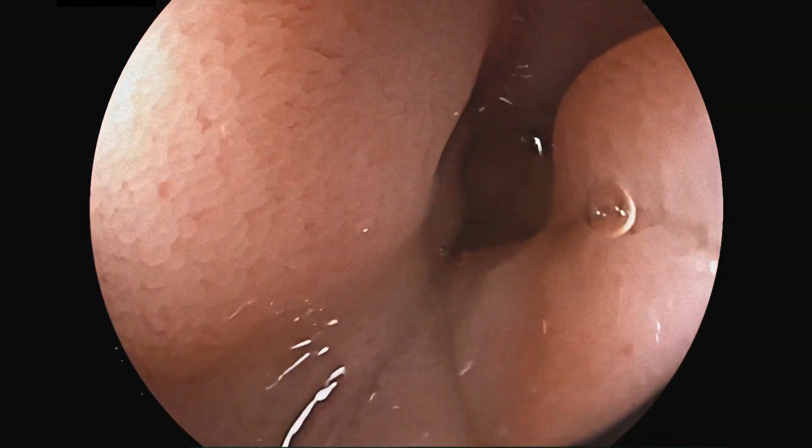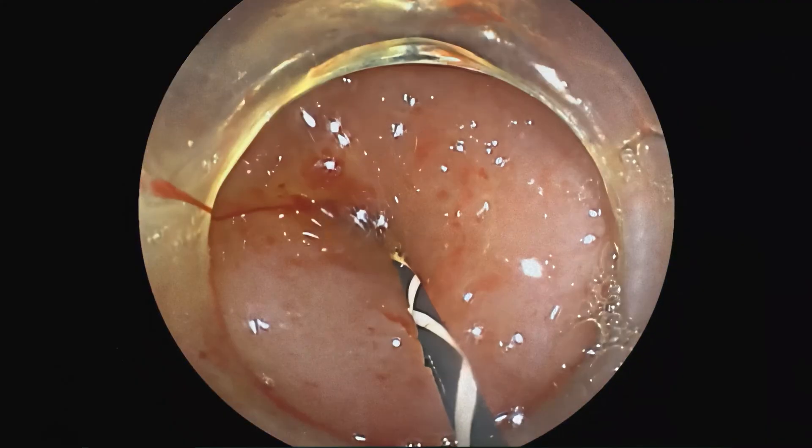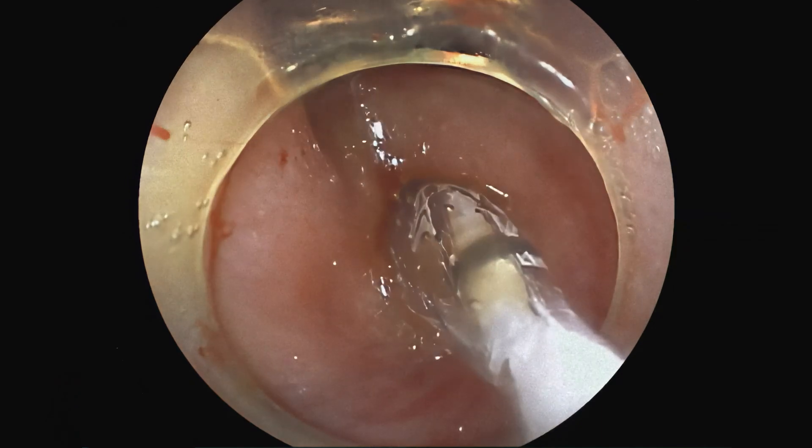The double balloon scope can also be used in patients who have altered intestine, pancreas, or liver anatomy from prior surgeries. It can be used in these patients to visualize concerns of gastrointestinal bleeding and other issues at the sites of intestinal attachments.